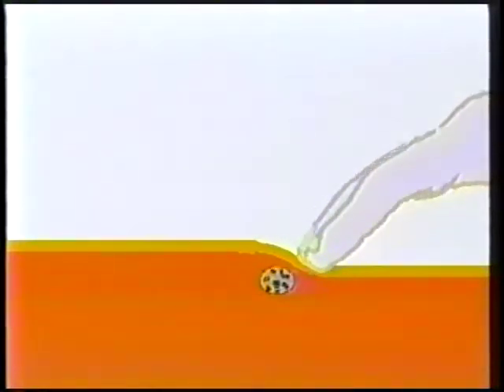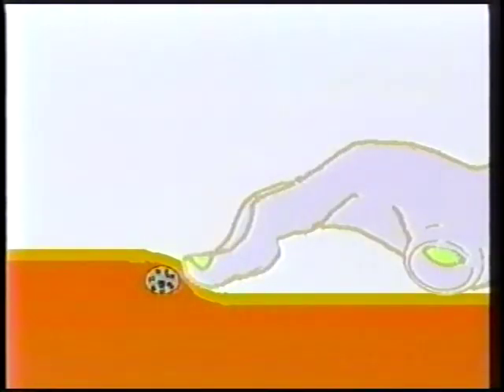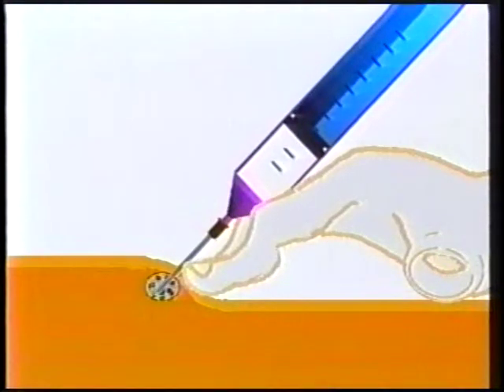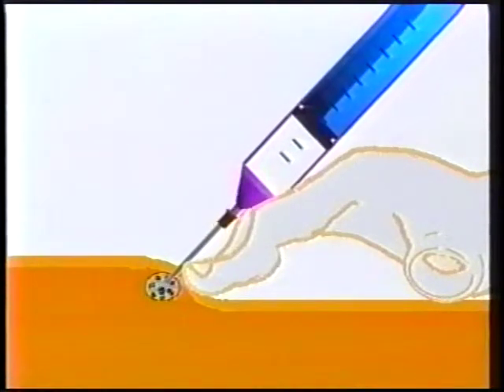This is a method for immobilizing small, less than 1 centimeter movable, well-defined subcutaneous lesions. With the fore and middle fingers of the non-dominant hand, walk the nodule under the skin. Keep pushing until the nodule is trapped. Without lifting the fingers, pull back, stretching the skin over the nodule. With the fingers still in place, clean the skin and insert the needle tip for sampling.